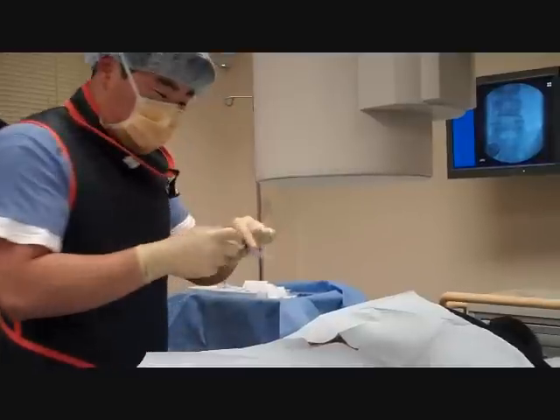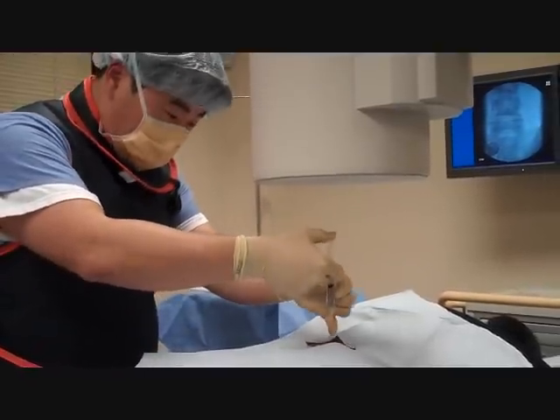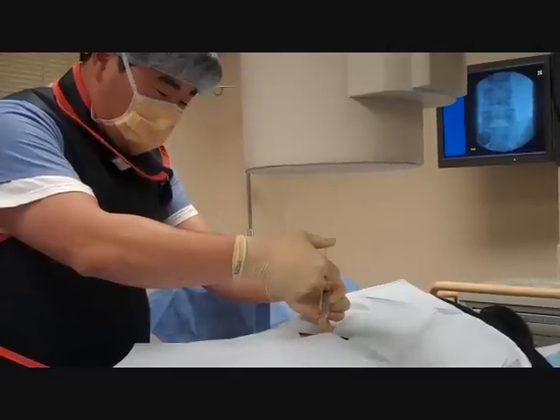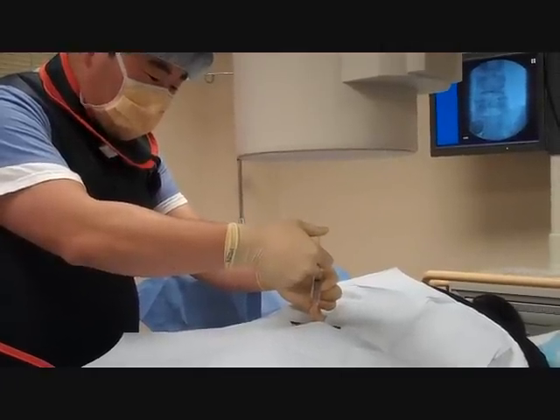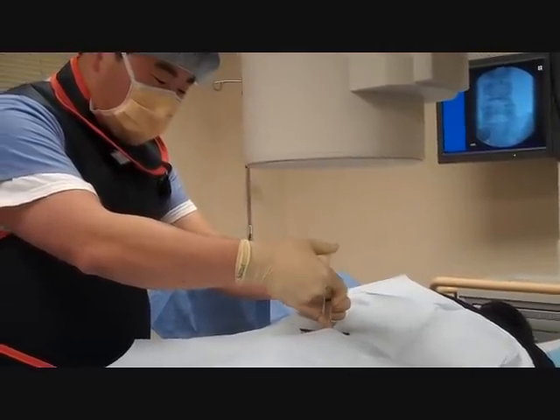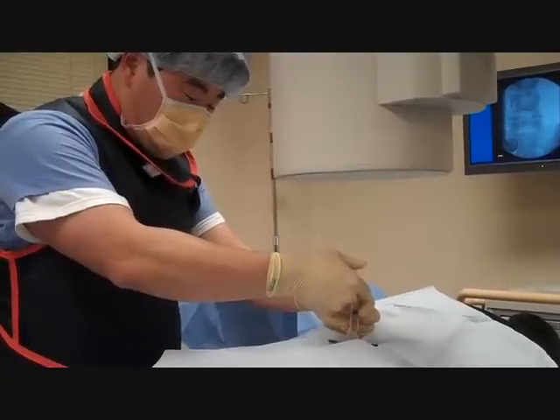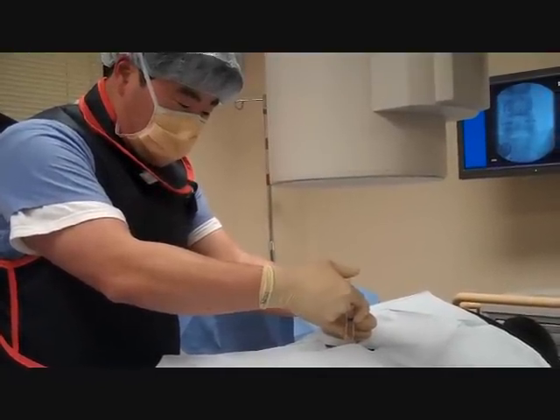Here comes some numbing medication — one, two, three, pinch. This is pretty routine, we're just numbing up the skin, just like going to the dentist — you get some Novocaine and numb up the area prior to any tooth extraction.